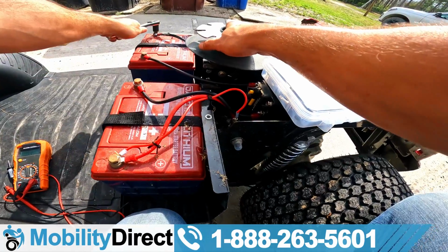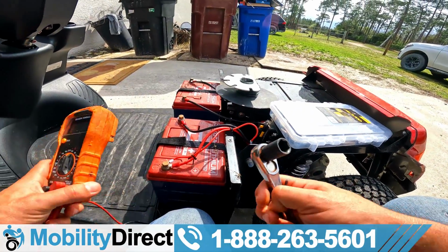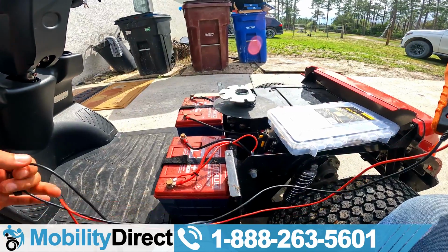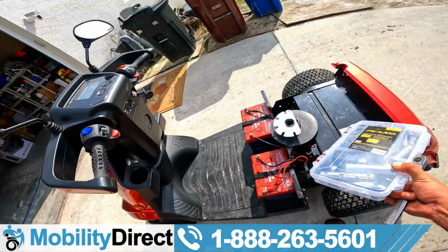So if you're getting down to like 24, that means it might work, but it might also limit your top speed. This machine, it can sense when the battery voltage is low, and it'll limit your top speed, so that way you're not going full speed and draining the battery too quickly, which is a pretty nice feature.